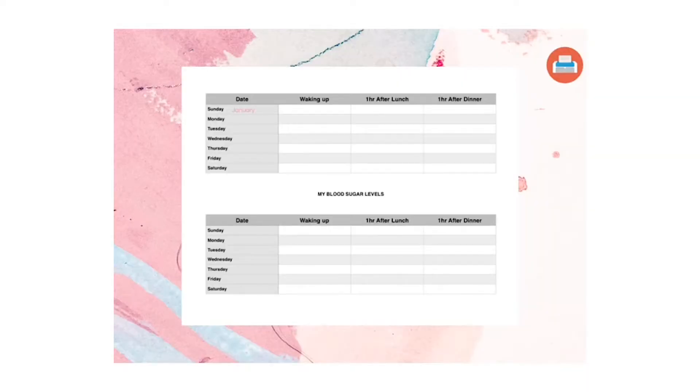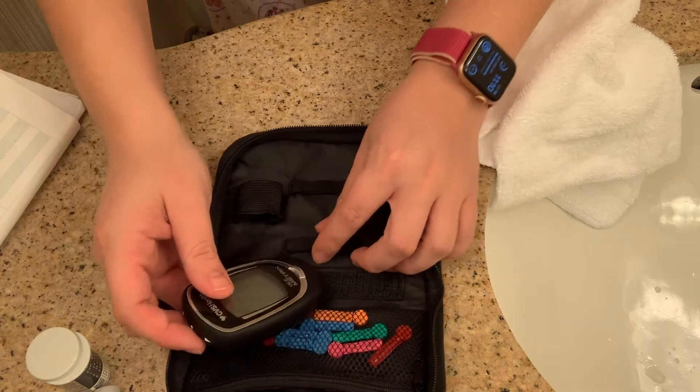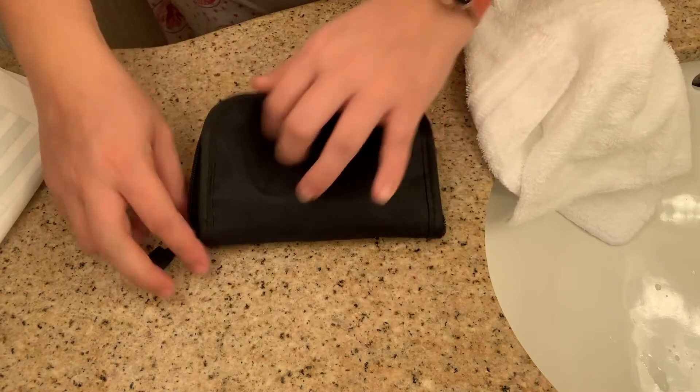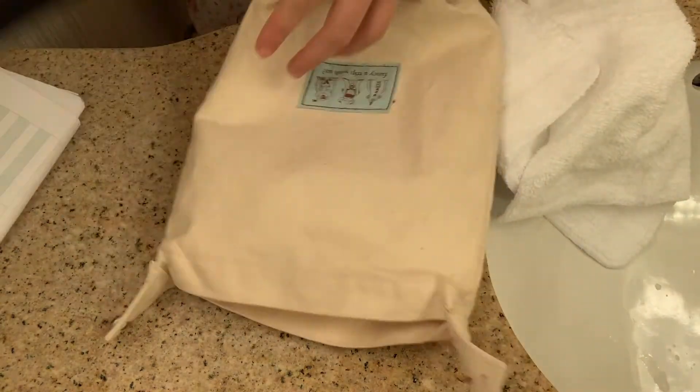This is the log I use to record my results — it's super easy to make. I made this one using a spreadsheet on my computer and transferred it to a JPEG so I can print it out anywhere and have extra copies. Once I'm done, I put my kit back together, grab my log and pen, and put everything back into my designated bag so I have everything together when I do my testing.